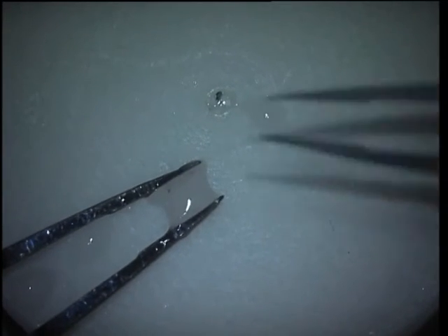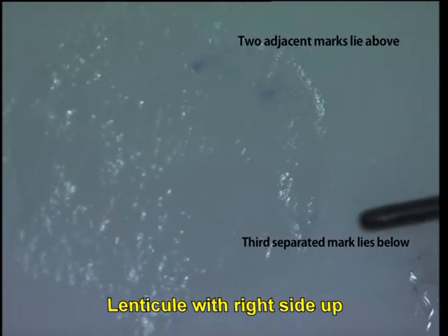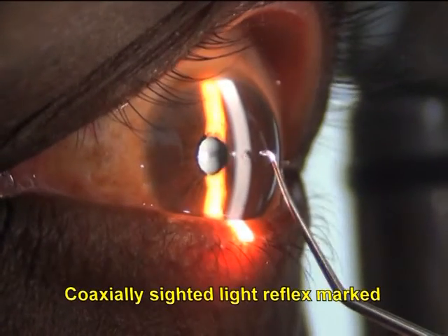Just prior to use in the presbyopic patient, it is taken out and spread out, and the anterior site is identified again on the basis of the marks. Once that is done, a small device of between 1 to 2 millimeters is used to punch out a small inlay.